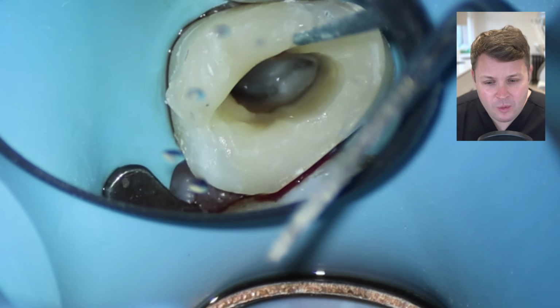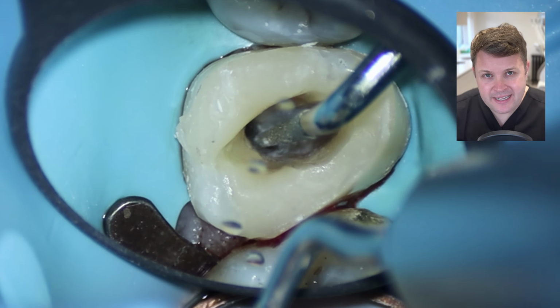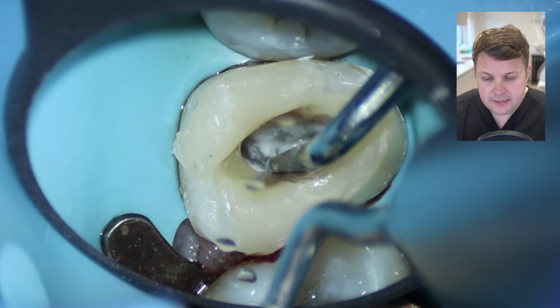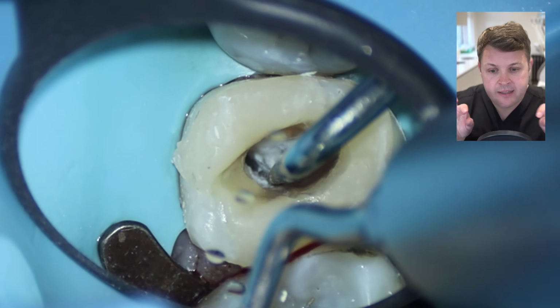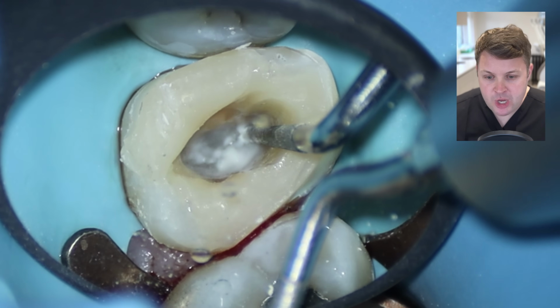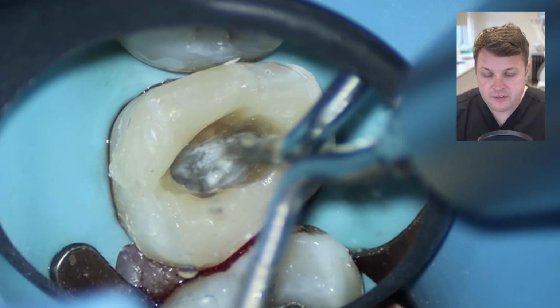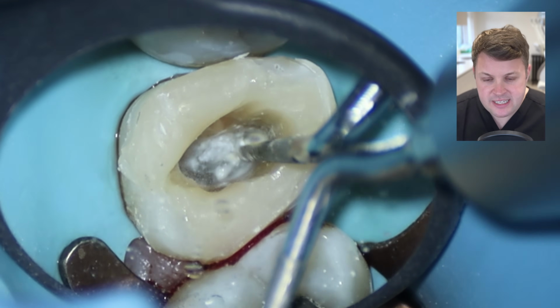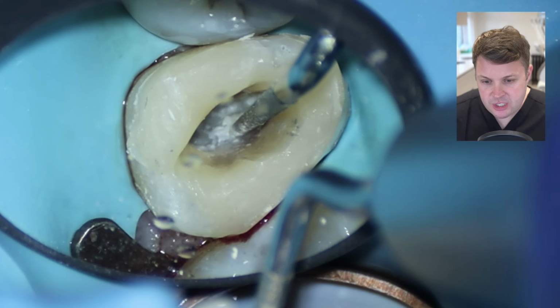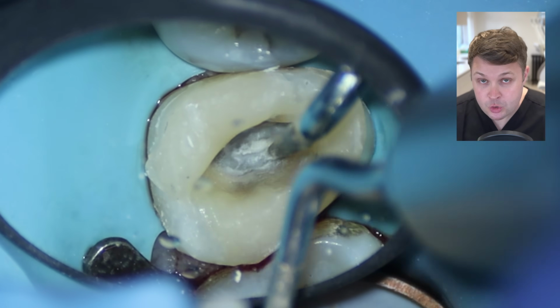I can't quite work out where the DB is, because when we look at the MB, it looks like it's by itself, like it would be a palatal canal. And when I look at the palatal canal, there looks like a little bit of a slither, maybe of the pulp chamber, or sometimes canal orifices can look like a bit of a slither, and I can't actually see where the DB is in this case. I've got a suggestion: it is nearer to the palatal than the MB, which is really, really unusual.